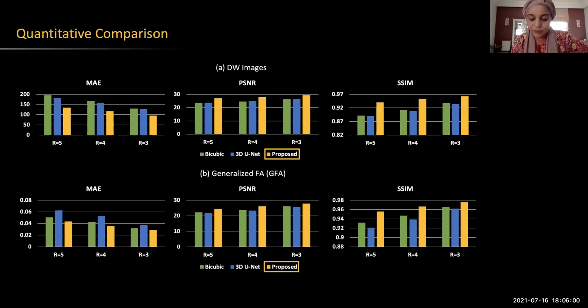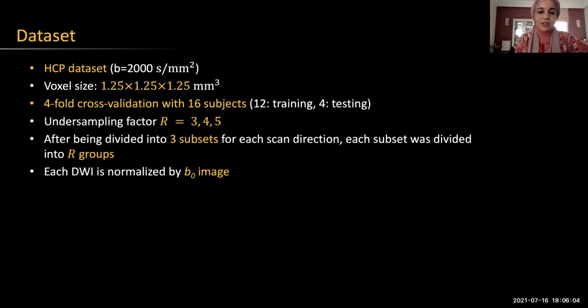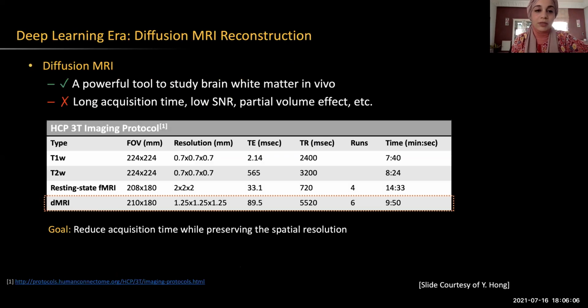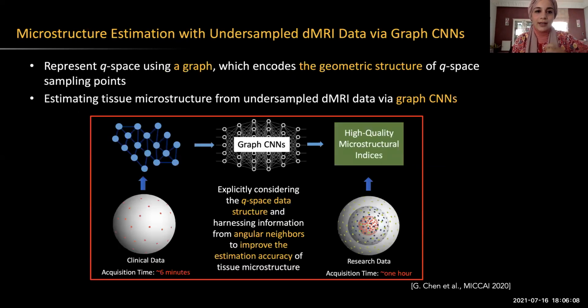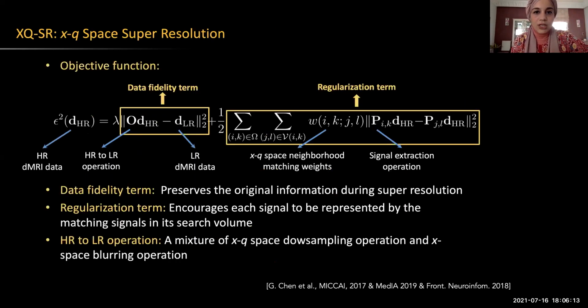In terms of the super resolution work, which I find very interesting, and clinically extremely relevant, you're trying to get microstructure images from low resolution images, and also high resolution diffusion MRI from low resolution. So we have this objective function. Maybe you can clarify a little bit what exactly you're trying to estimate or learn?